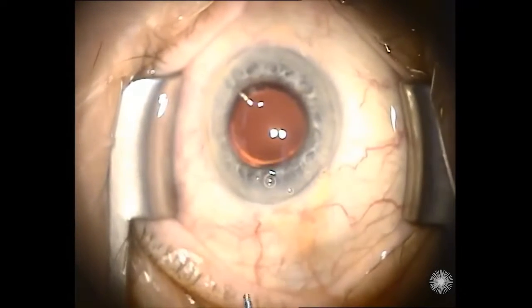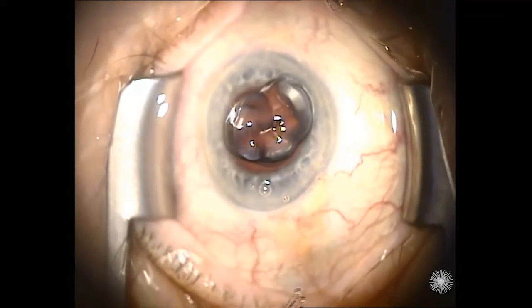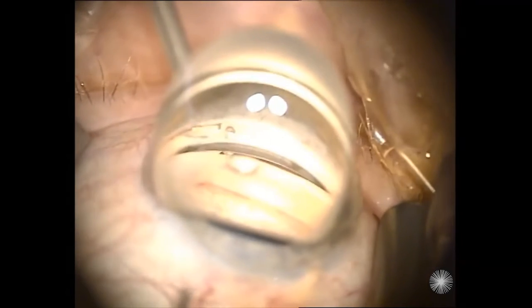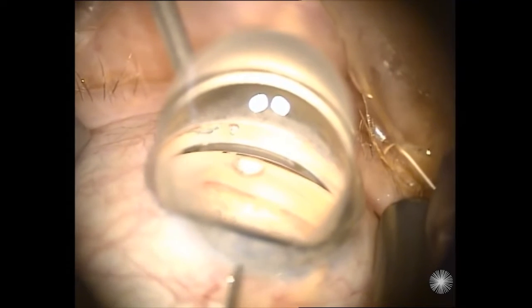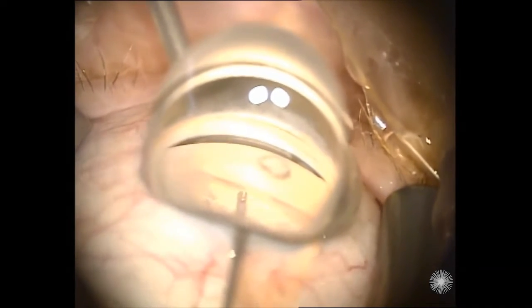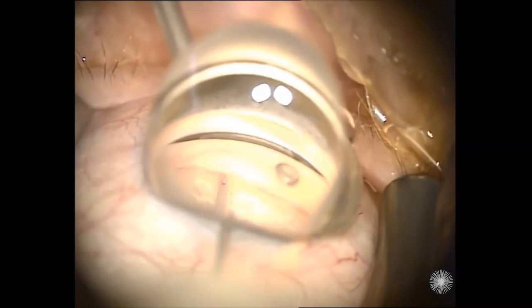We'll put more viscoelastic over the cornea, and we'll move the head of the patient and the microscope approximately 35 degrees to get a clear view of the trabeculum. Then we'll put the prism. The trabeculum here is well pigmented. We get our injector through the side port, and we will implant the first iStent.